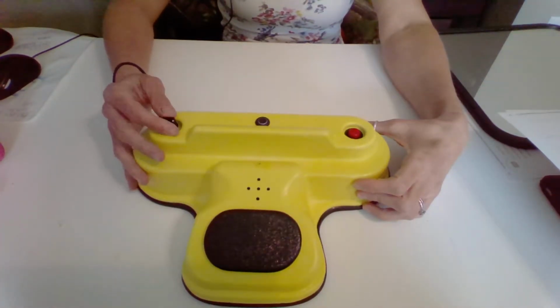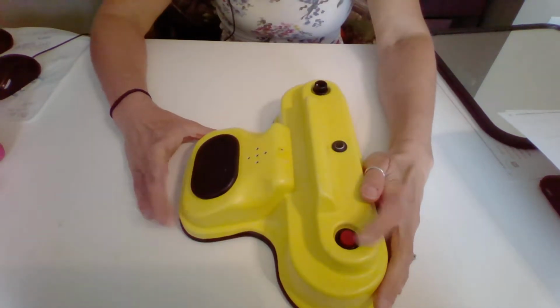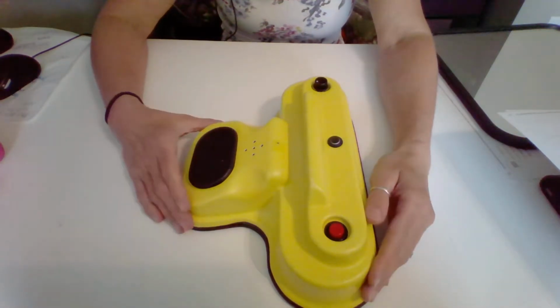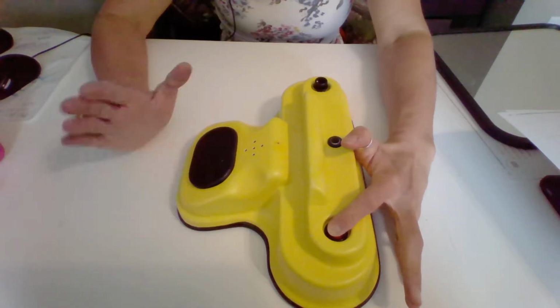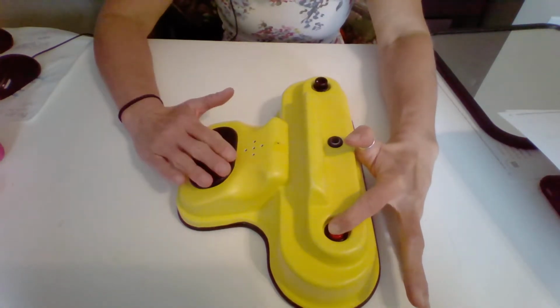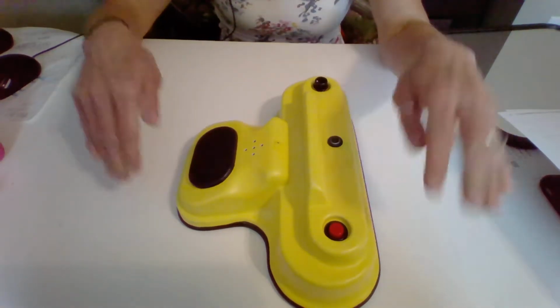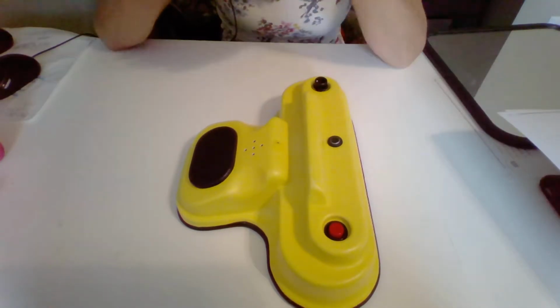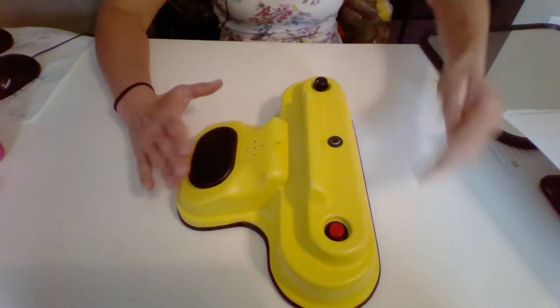Anyway, okay, so I turned it on. Make sure I got it right again. Okay, turn it on. You need to use the red button and the black button simultaneously in order to get the recording to work. I found the easier thing to do is to just hold the red button down first, then press the black button at the same time. Keep this pushed down and then hold this in while you're talking. Both of these buttons have to be depressed. So, blah, blah, blah, let go. Once you let go, the recording stops. Then you hit the black button only to play your recording.